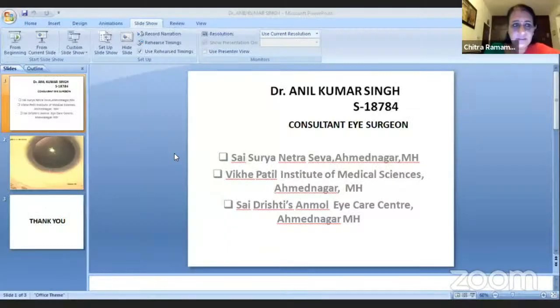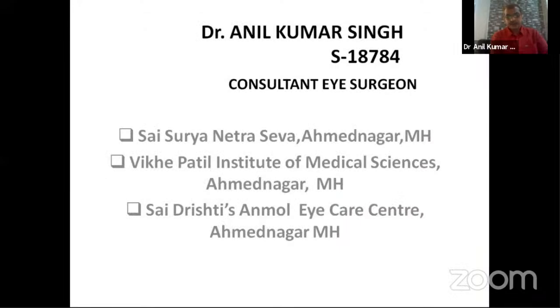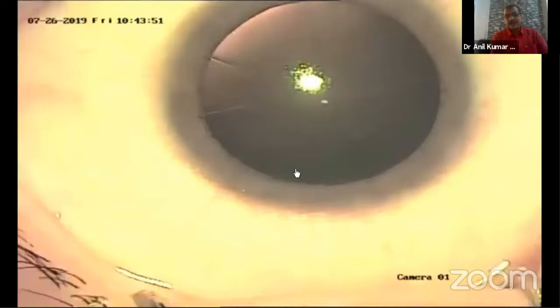Yes, fine, excellent. So I'll be talking about a patient, post RK, radial keratotomy done nearly 30 years back by my guru Dr. Prakash Kankriya sir at Sai Surya Netra Seva. We opted for this case because this is not a very tough surgery as such, but there are a few tricks where we are supposed to judge before starting the surgery itself.